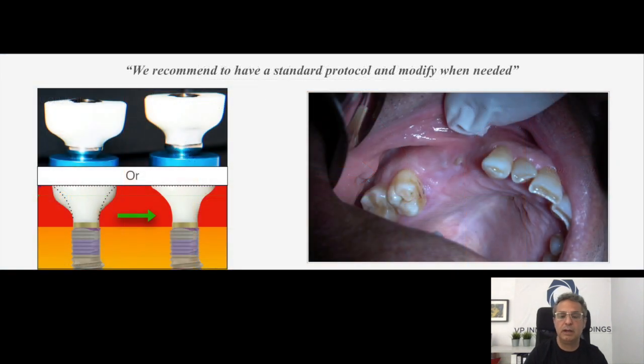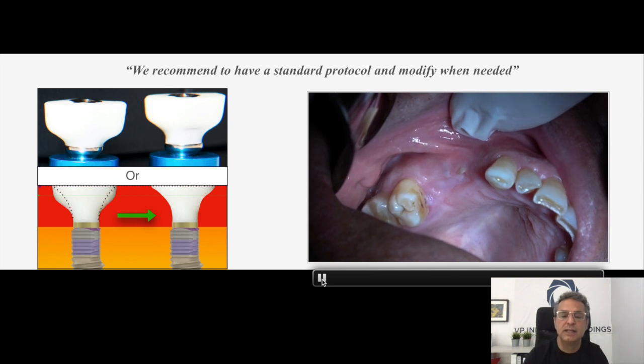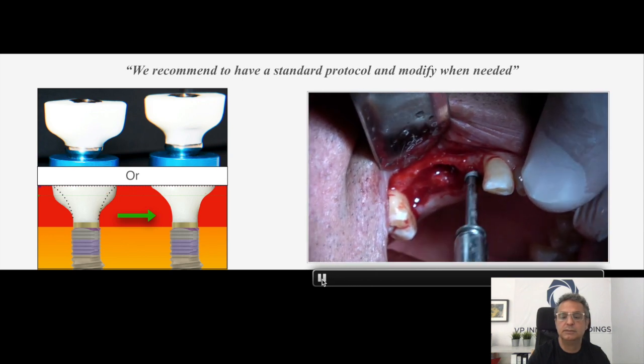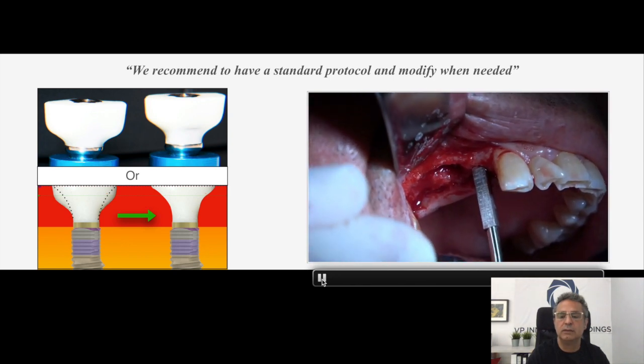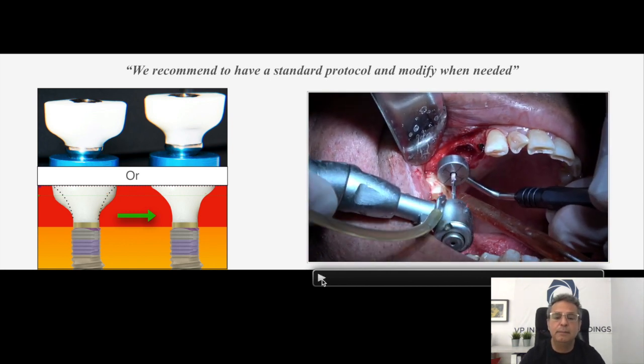So this is a little video here. I'm going to stop and start it as I'm talking to you. It's just a wonderful little video that shows a few little tricks done by my partner. He's got the pin in position, puts his first implant in. He will check with the depth gauge to see how deep he is. Now, as you can see here, he's lined up the tab. There is the T line, which is the markers on the actual laser on the tab itself. And he will drive through with his pilot drill and he will have a perfect osteotomy.